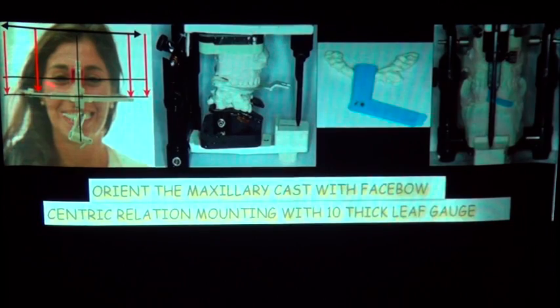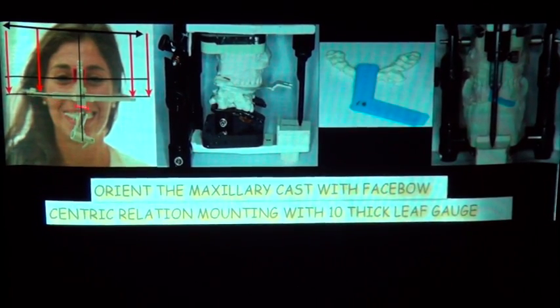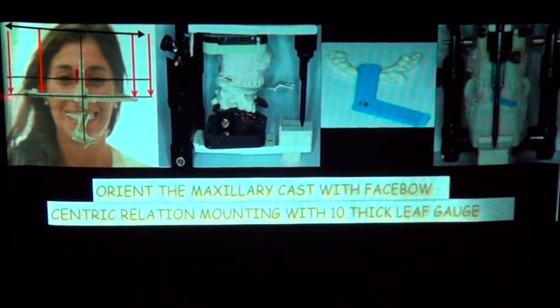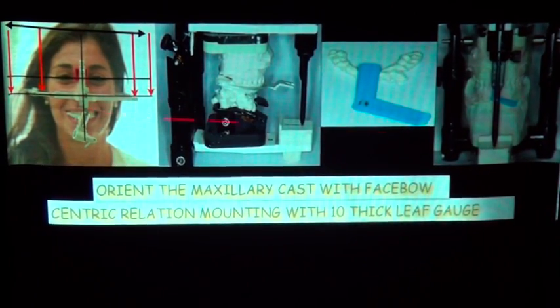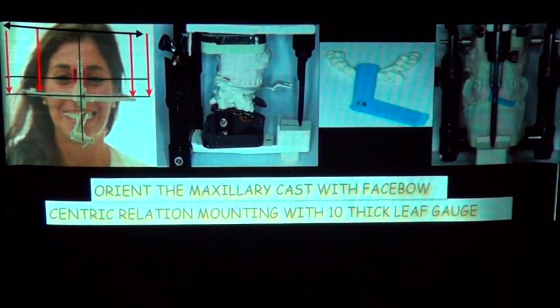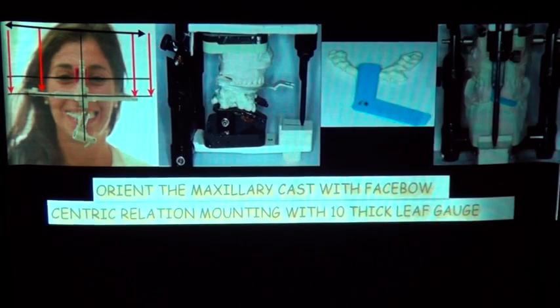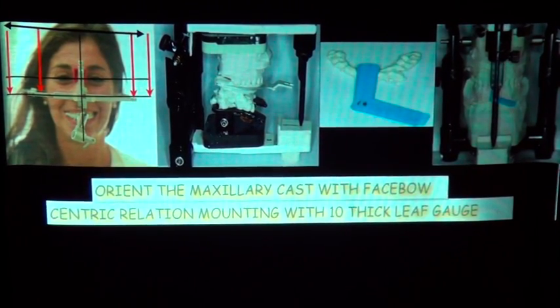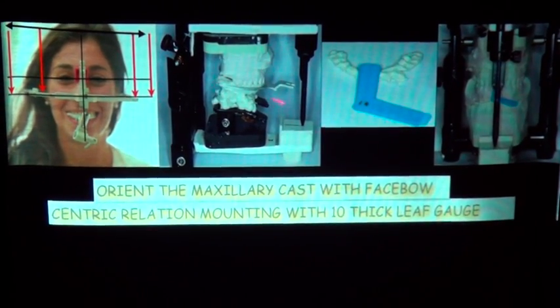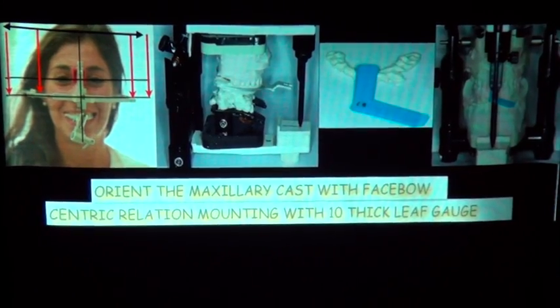So now when you take the Facebow and put the maxillary cast on the bow, and you mount it, this side of the bow is lower than this side. When you mount it, you raise this up, and what happens? Does anybody know what happens? The cast gets mounted crooked. Right? I mean, you're getting some approximation of the arc of closure, because you know this is approximately where the hinge is.